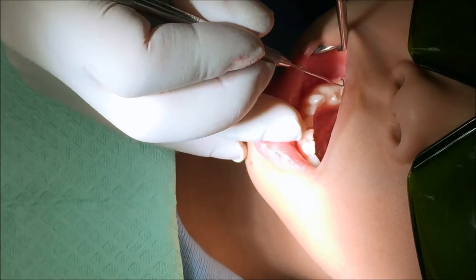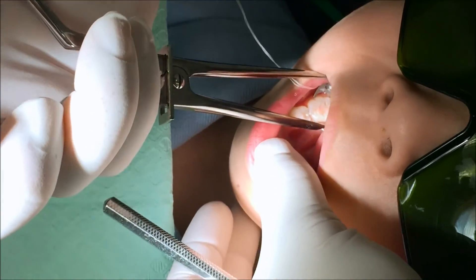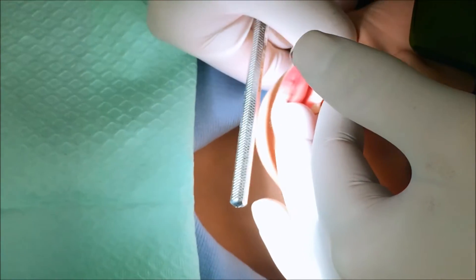Alright, the gum is nice and sleepy. I'm gonna give you the little hug with the ring. I'm gonna count to three before I give you the hugs, just like last time, so it won't be a surprise. Here we go — one, two, and three. Very good. Let me check, make sure the ring is nice and straight. Beautiful.